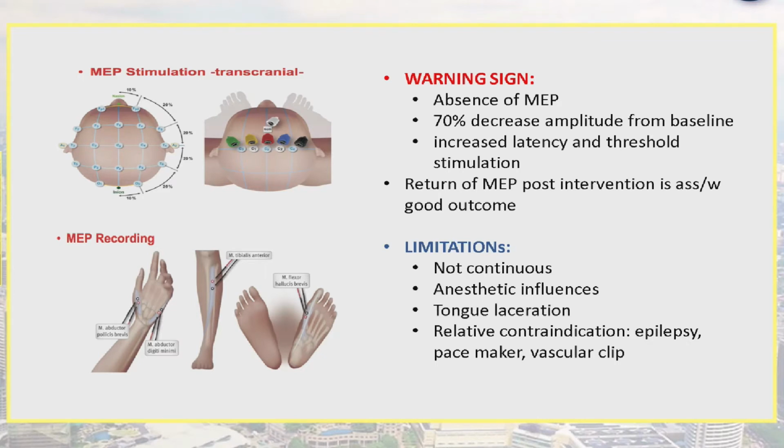However, the limitation is it is not continuous. We need to stimulate, then we can see the response. So it's used in spine surgery because of the dynamic changes in surgery, like pedicle screw insertion and retraction. So at a certain point of interest, they will do MEP to see the response and to evaluate the neurological status at that time.